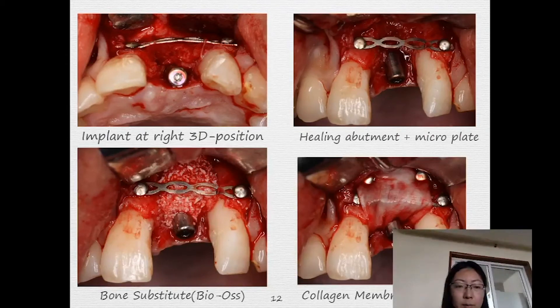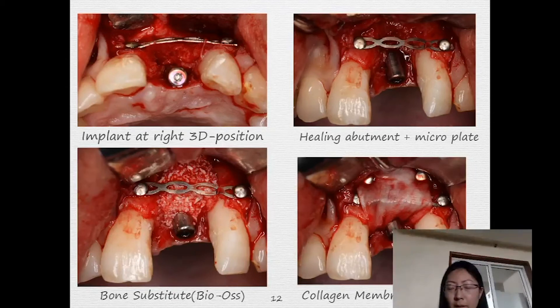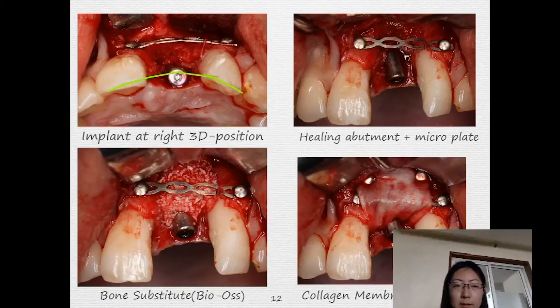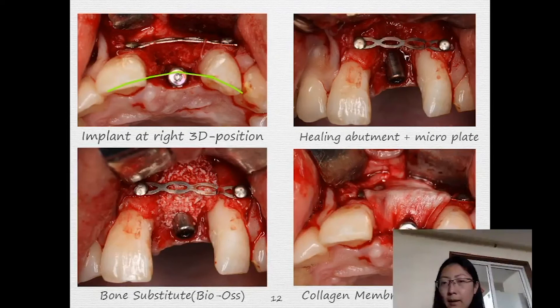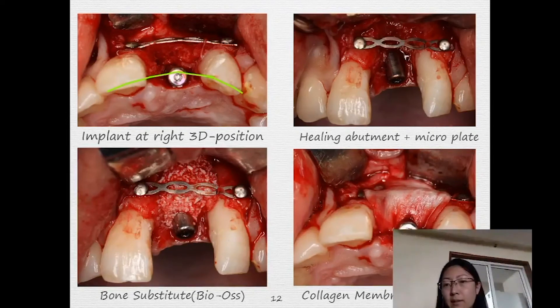We use bone substitute by OTH here to augment the defects, and another collagen membrane to cover the whole area. From the occlusal view, we can see the position of the implant and how firmly we can maintain the space by the titanium material.